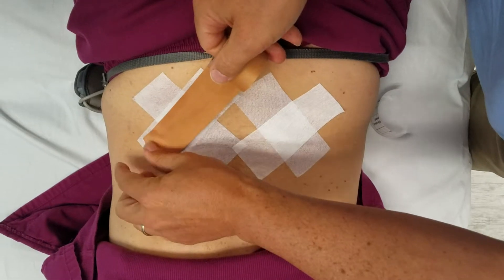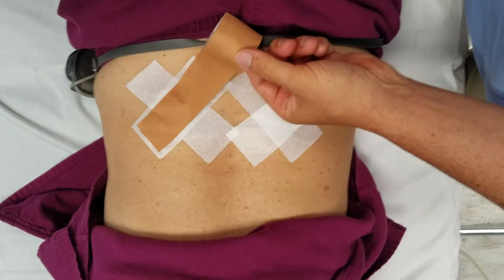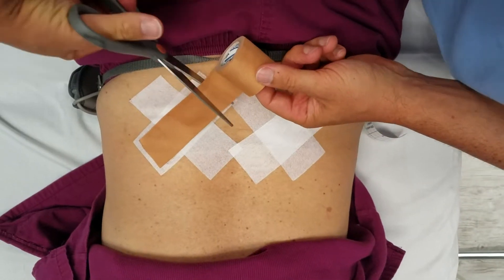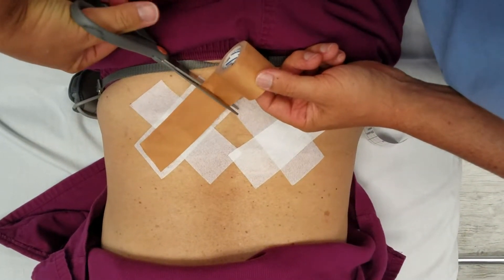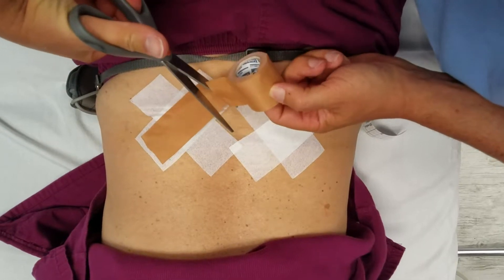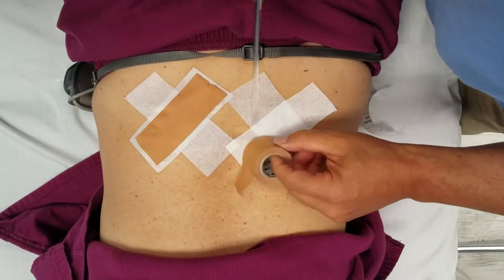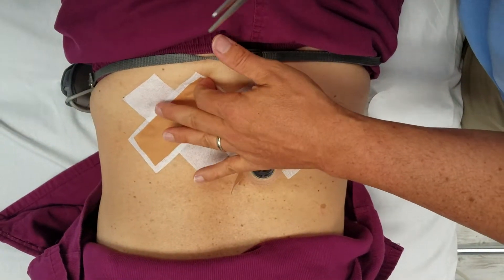When we stabilize the facets so that you can't get that hyperextension and get flexion out of the facet, we prevent a lot of progression of disease, especially after we've done some regenerative medicine. We don't want that tissue to be stressed for a while.